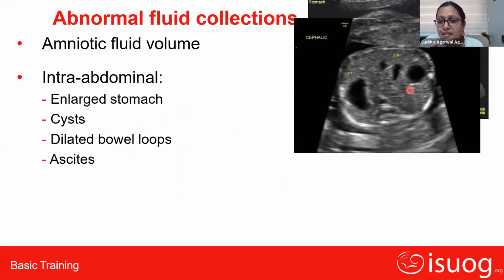So in this case, it is a cephalic presentation. Again, we have to see two things. We need to see the position of the fetus. It is a cephalic presentation, and there is a spine. So what happens? Cephalic presentation means this way. This should be my hand. Cephalic here. Spine is down. Spine is down means my hand will go like this.